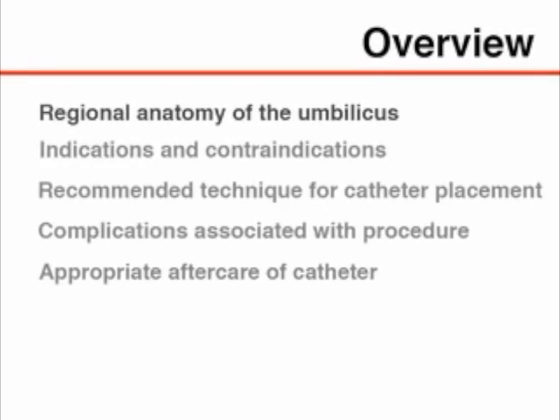We will demonstrate the regional anatomy of the umbilicus, indications and contraindications for the insertion of an umbilical catheter, the recommended technique for catheter placement in both the umbilical artery and vein, selected complications associated with the procedure, and suggestions for how to avoid them, and appropriate aftercare of the catheter.